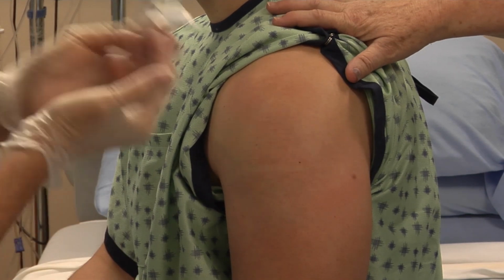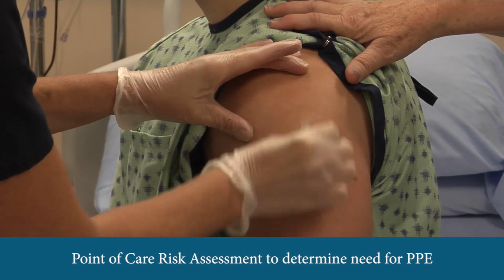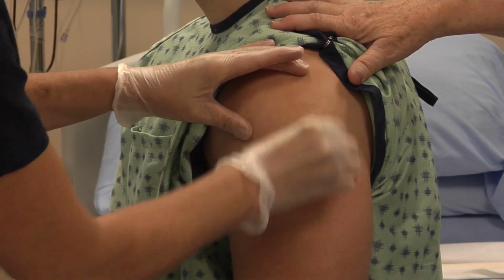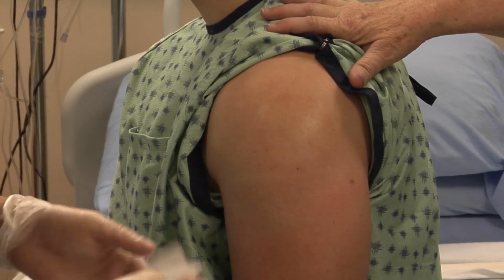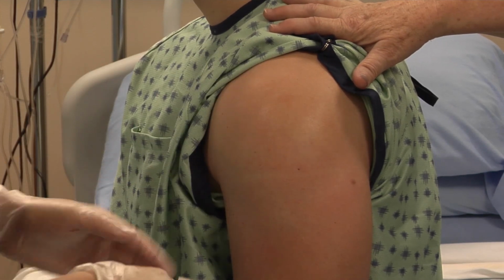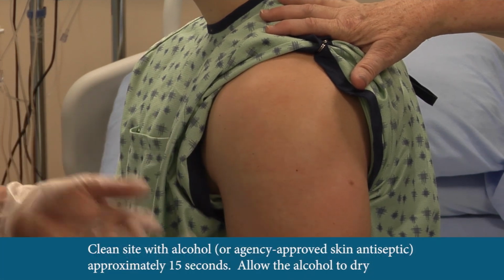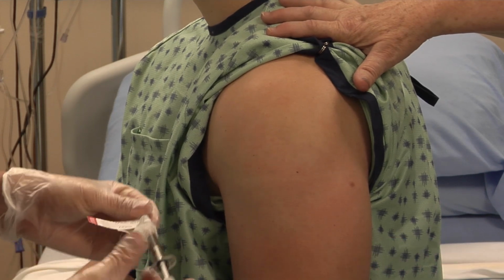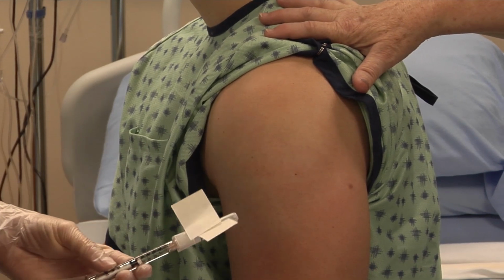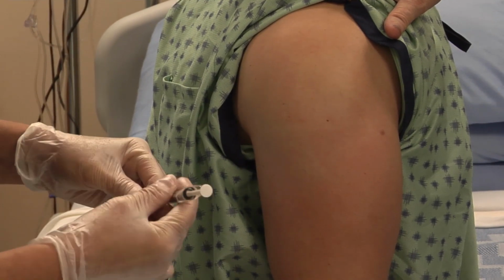So I've done some hand hygiene. I've made a choice to wear gloves. I'm going to clean my site from the inside out. The literature is inconsistent about how long you should clean the site for, but what's very consistent is that you have to let the alcohol dry. It doesn't have antiseptic properties if it's still wet. Okay, so I'm going to just do one last check on my med before I give this to him.